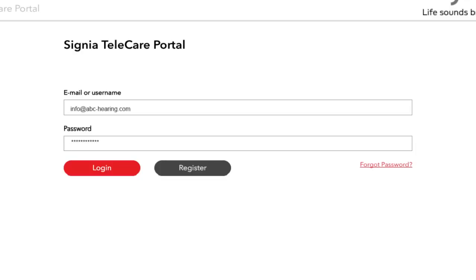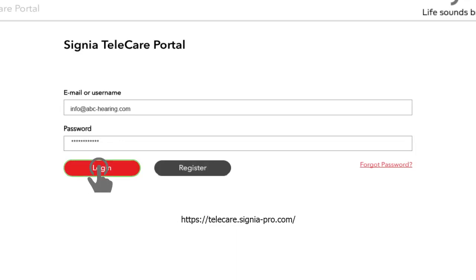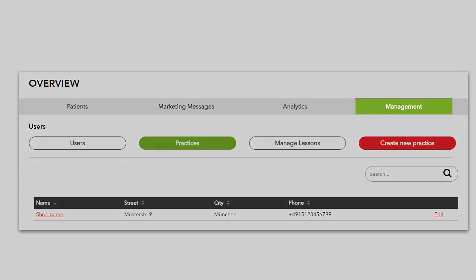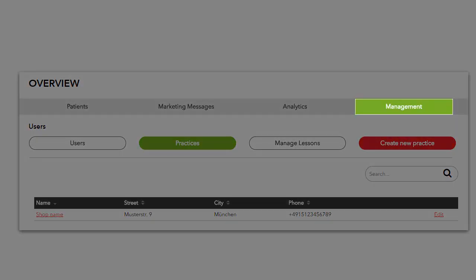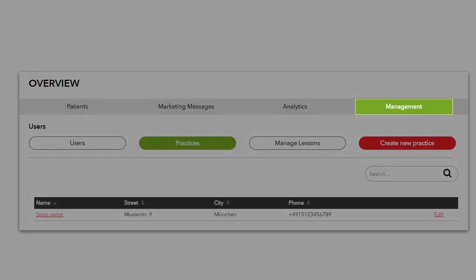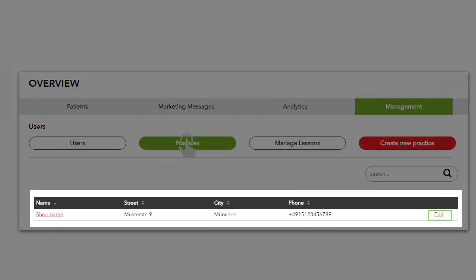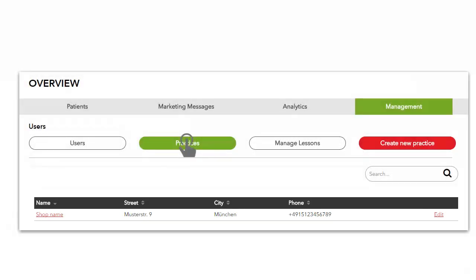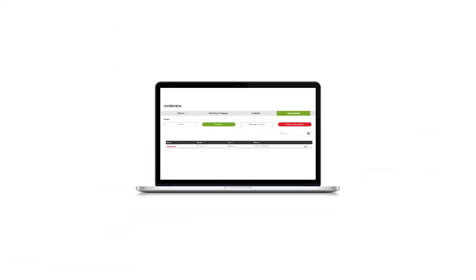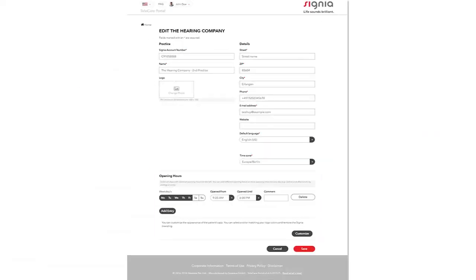You have the possibility to edit your details any time. Log into the Telecare Portal with your email and password. From the main menu select Management followed by clicking Practices. In the Practices Overview list click Edit to complete or edit your practice details. You can upload your opening hours if desired.